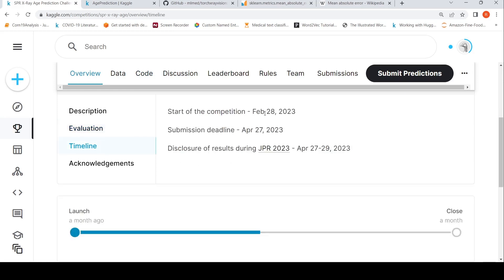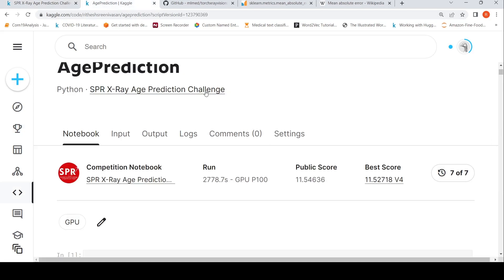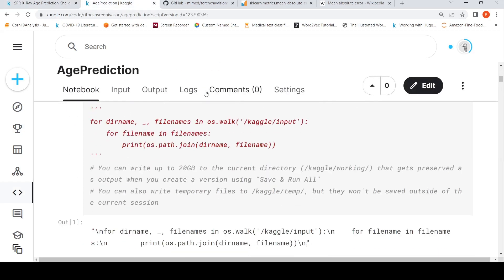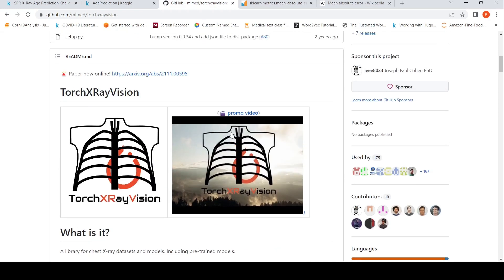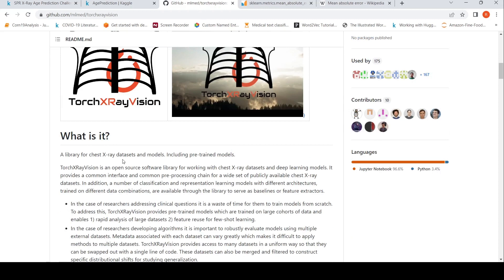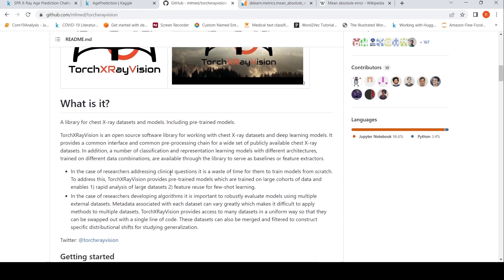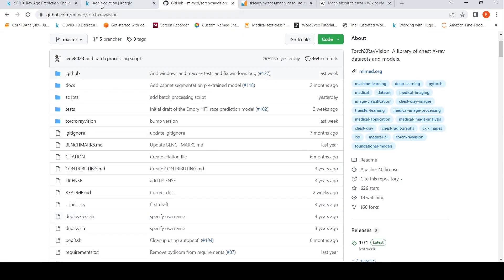There is also a timeline: April 27th is the submission deadline and results will be disclosed at a conference. To extract features from chest x-ray images using deep learning, I found a library called TorchXRayVision — a library for chest x-ray datasets and models. It includes pre-trained models trained on chest x-ray data and is open source. I will use a pre-trained model from this library to extract features from the images.